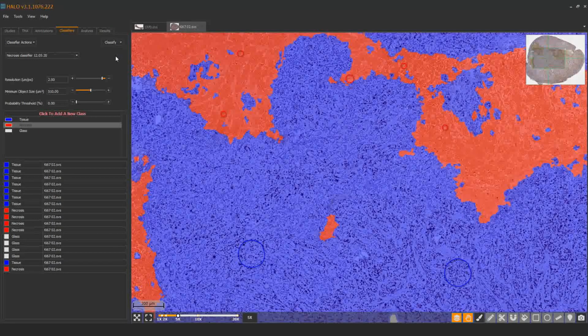Okay, so I'm going to pause a second. Are there any questions on the classifier and how that should work? Okay, I'm just going to quickly check in with my colleagues. Is the screen okay and the audio still working well? It's good. Okay, thank you.